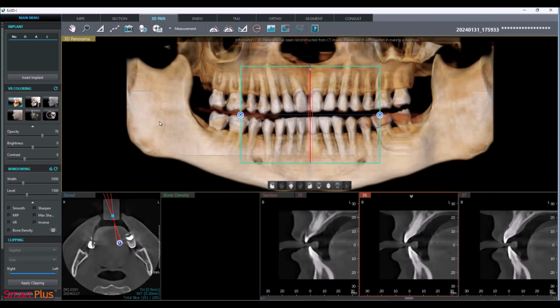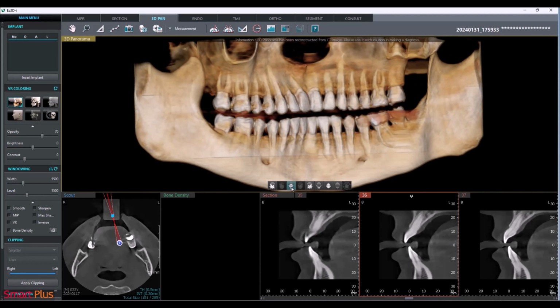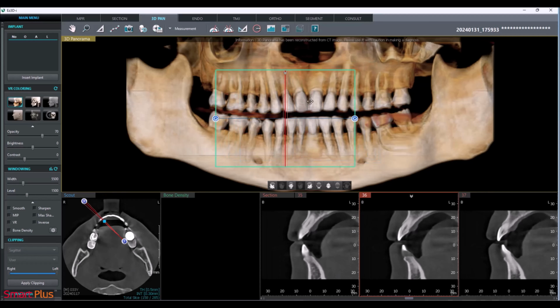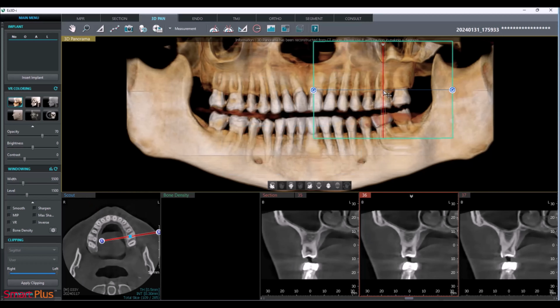The 3D pan essentially takes your 3D rendering and flattens it out into a navigatable image. Here are your quick buttons. Center of the screen, we have our navigation window. I can left click and drag in a negative space to move this around, exploring the image. I can also double click on an area to navigate quickly to a certain area.